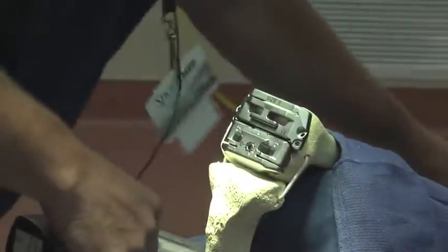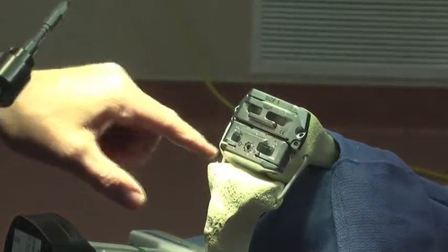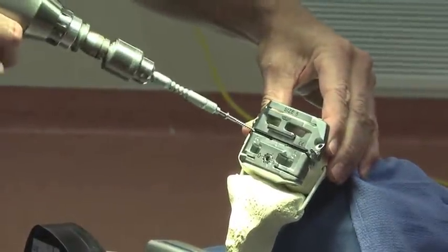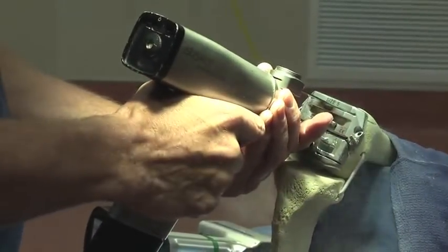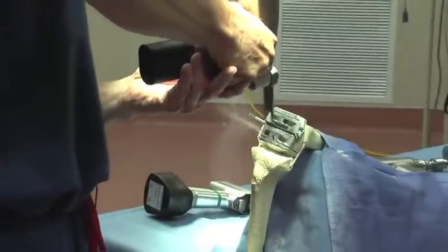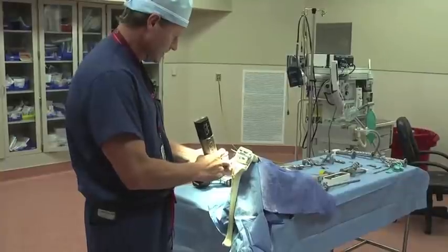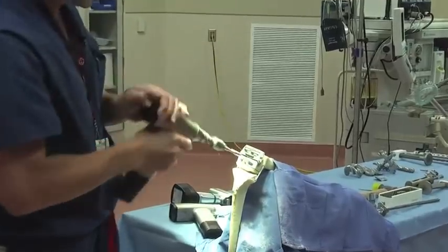Next we'll have to pin that cutting block in place to keep it good and stable. This block will make our front and back cuts, and what we call our chamfer cuts. We'll use two pins to stabilize this block and go ahead and make these cuts — starting on the top here, then making our chamfer cuts, and then coming up to make the top chamfer cut. The next step will be to remove the pins.